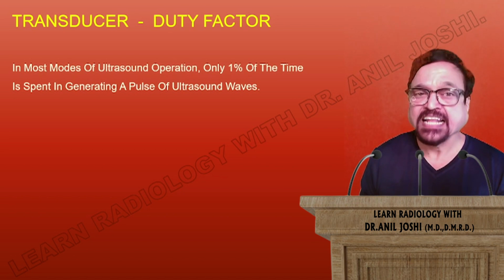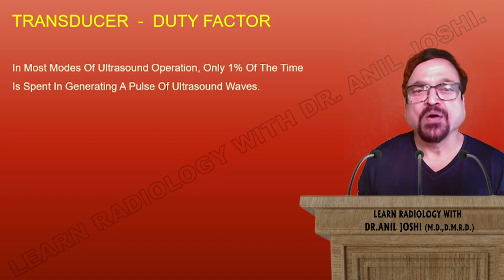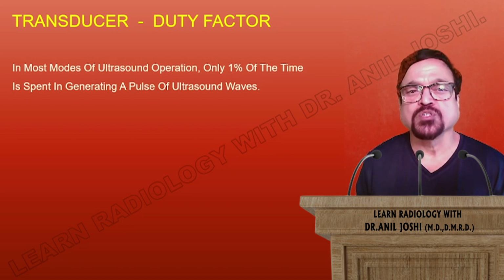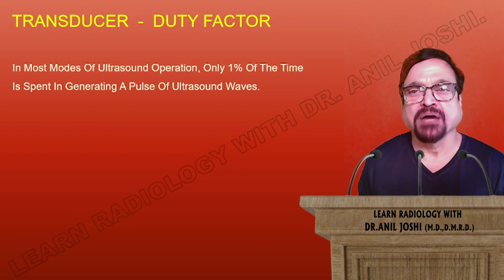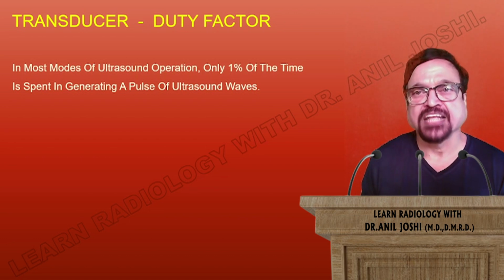These electrical signals produced by the piezoelectric effect are equivalent to the sound waves which are coming back. So brighter signals are produced by sound waves which are coming in greater number, and that is what is happening in the transducer. These topics are covered extensively in some other lectures.